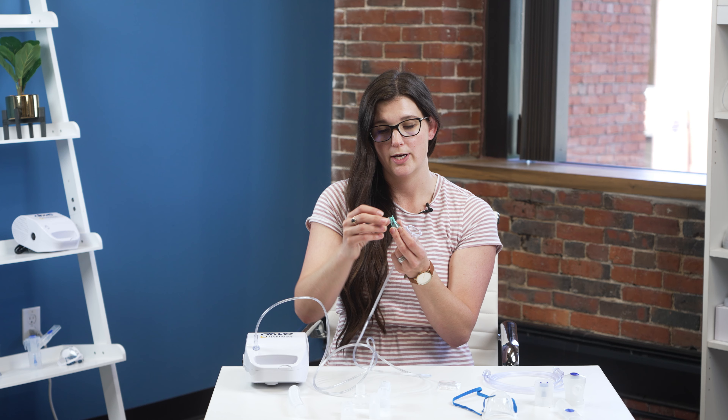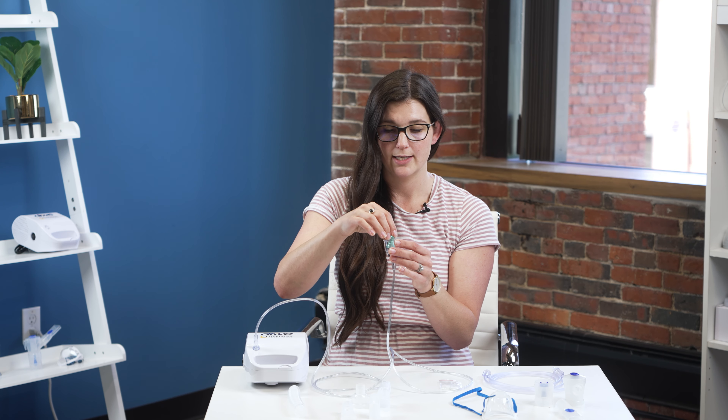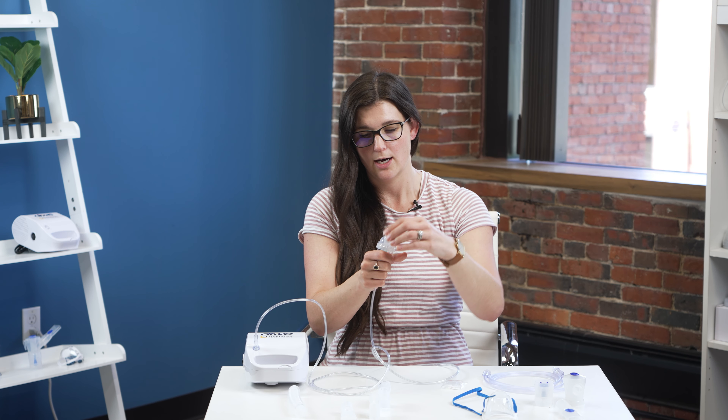We're going to assemble the disposable set now. It's very similar with a few different adapters and pieces. You're still going to start with the tubing — the ends are the same, so either one goes onto the compressor just like before. The other side goes to the bottom of the cup, nice and tight, all the way to the bottom. The baffle looks a little different and is a slightly different color, but it is still very important and needs to go in there with the medication. Then you put on the top of the cup.